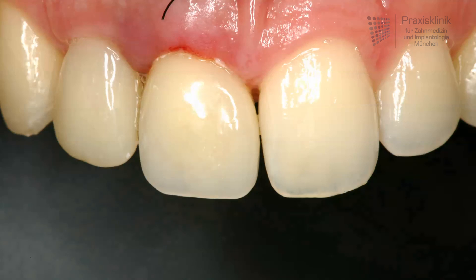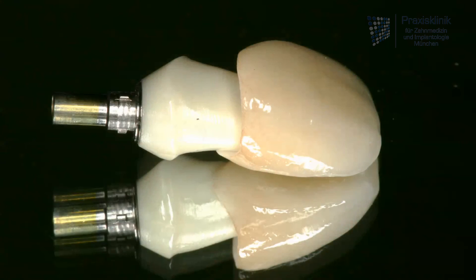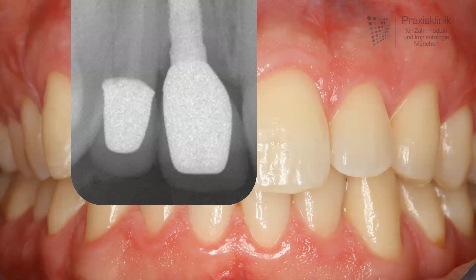After the healing period, the abutment and crown are removed, followed by impression taking, and now we can start with the final restoration. In this case, an all-ceramic implant-supported single crown with an all-ceramic abutment. The x-ray image shows the treatment outcome: the central incisor replaced by an implant, and the neighboring teeth restored with an endodontic treatment and also an all-ceramic single crown.